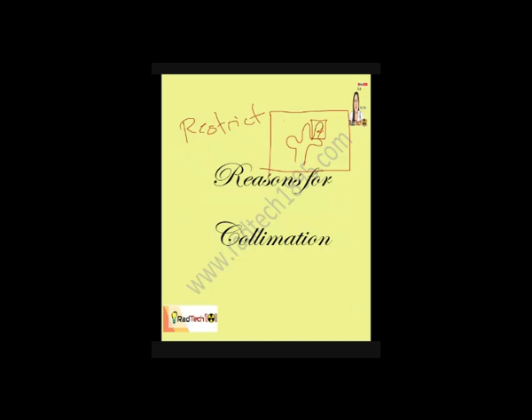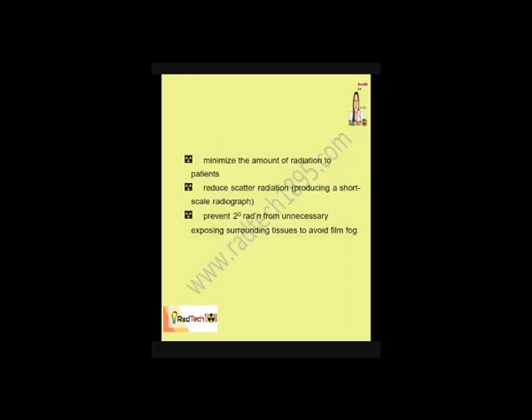So, bakit kailangan nating mag-collimate? This is to minimize the amount of radiation to patients kasi yung ibang part niya hindi na ma-expose sa radiation. Also, to reduce scatter radiation which can produce a short scale contrast or short scale radiograph. So, minimize amount of radiation reaching the patient, reduce scatter radiation, and prevent secondary radiation from unnecessarily exposing the surrounding tissues to avoid film fog.